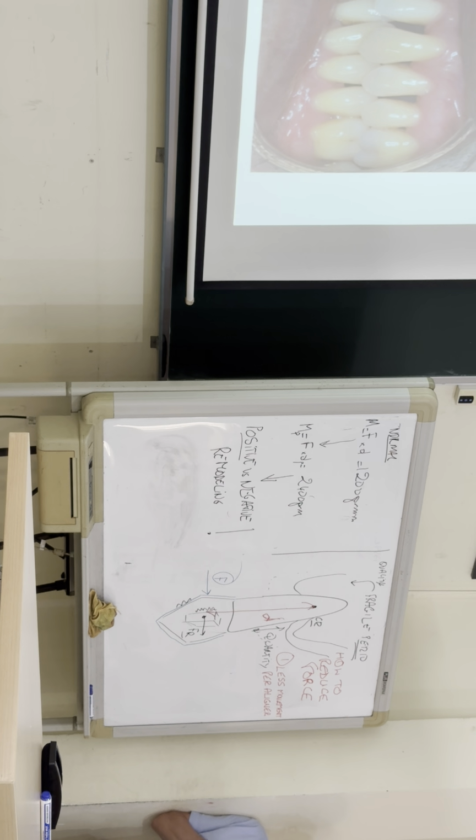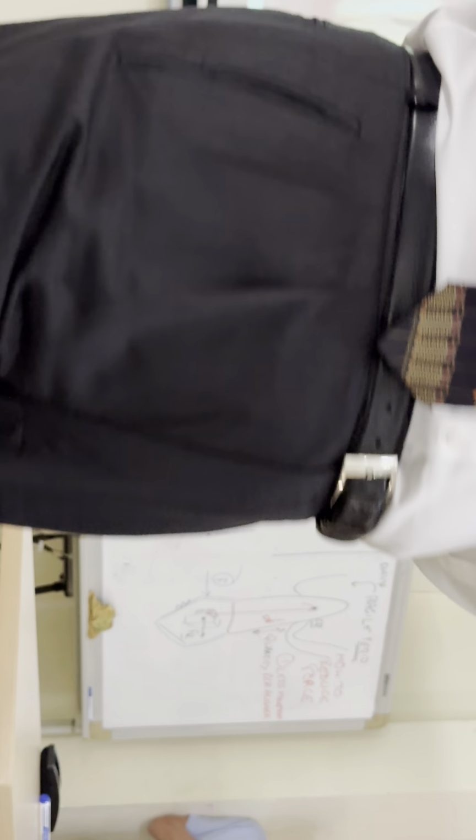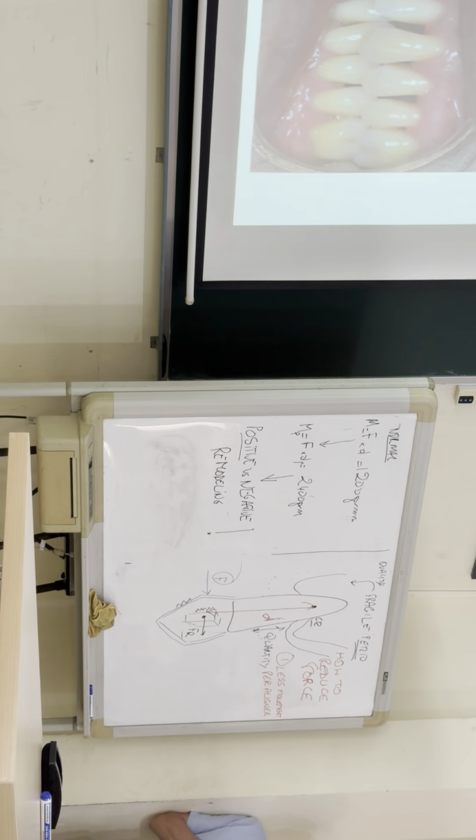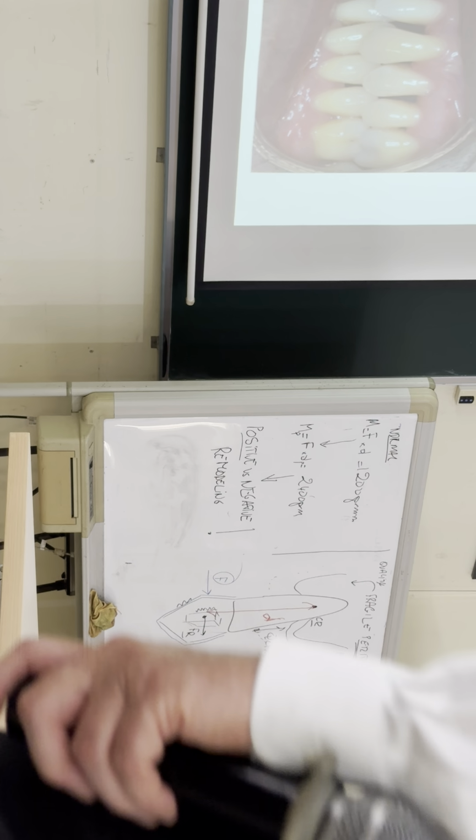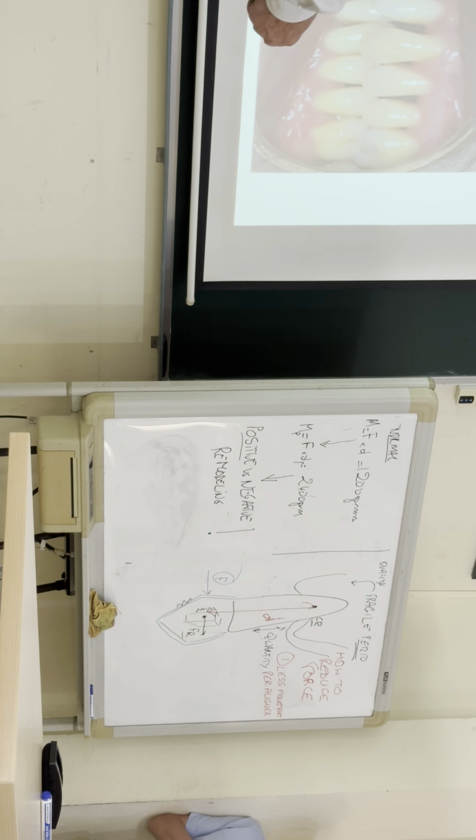Well, that's a simple case. So hold on a moment, because we're still trying to work out how to reduce forces. So what else can we do to this? We tell the lab, or when we're setting it up in Titan, we say instead of 0.2 millimeters, we're going to be doing 0.1 millimeter per aligner. What else can we do?